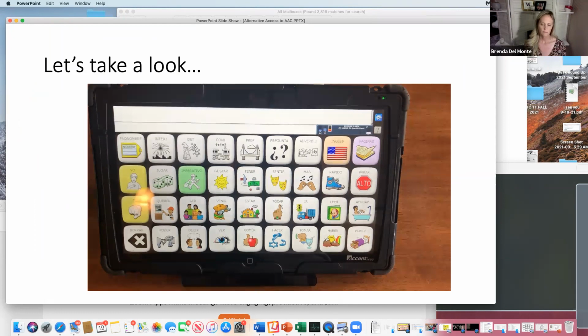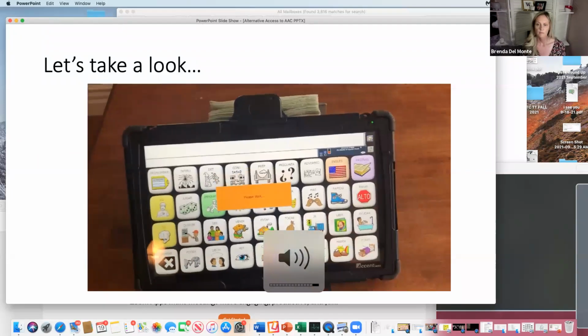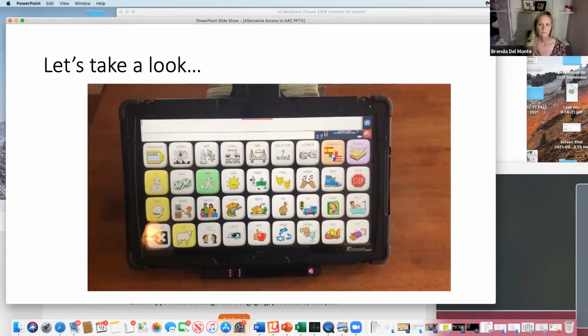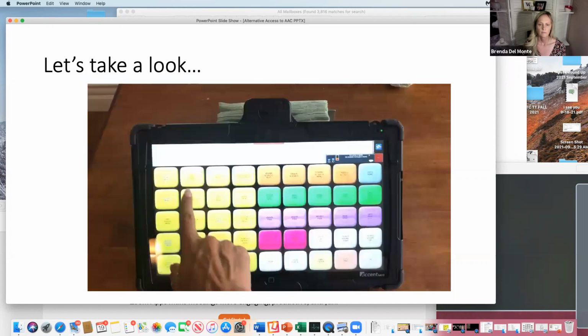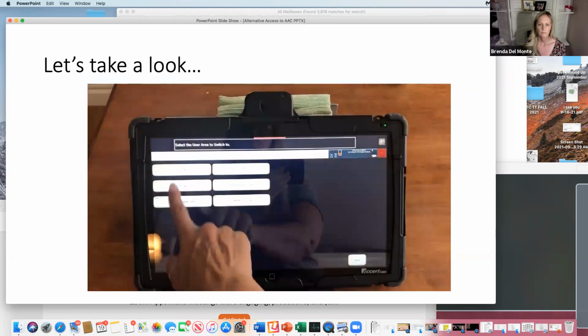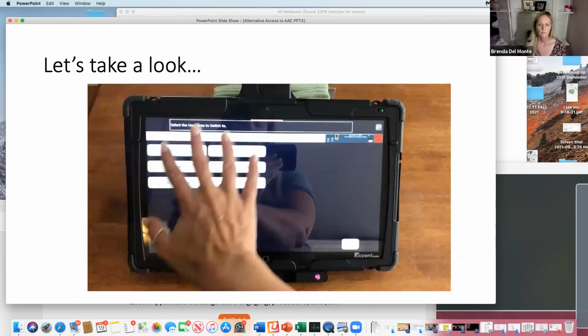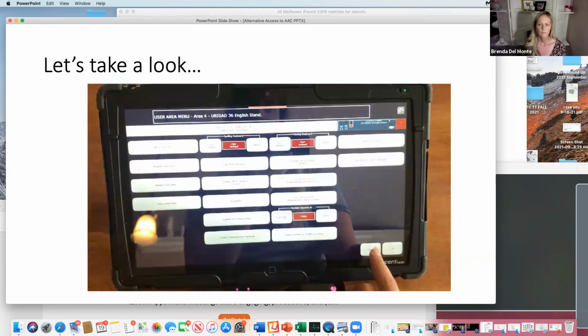So this is the Accent. We're on Unidad 36, which is why it's all in Spanish here. And when I hit English, it will populate the English side here. And you can go into the toolbox user menu and switch user to any kind of user that you might want. That language system is really more than we're going to get into today for the purposes of eye gaze, but you have options.